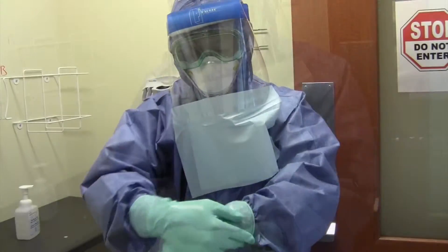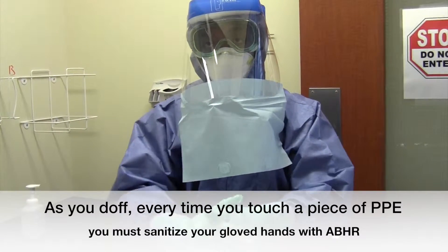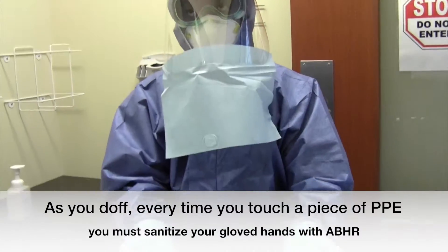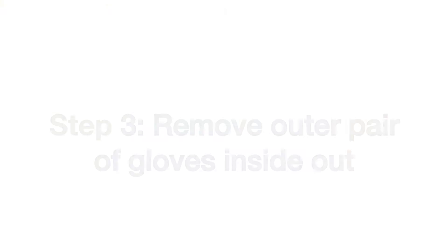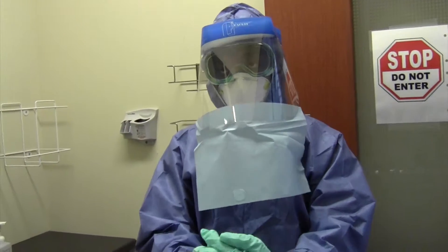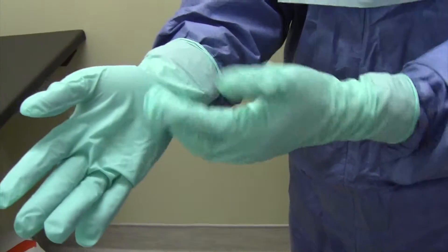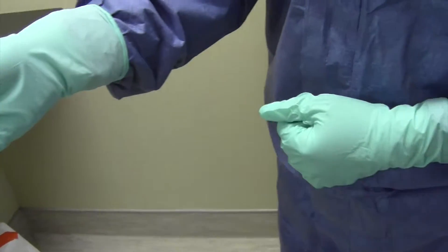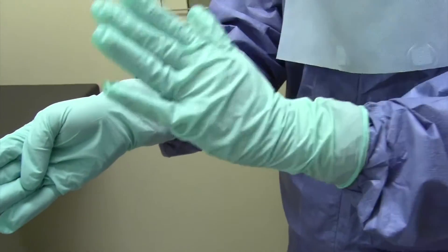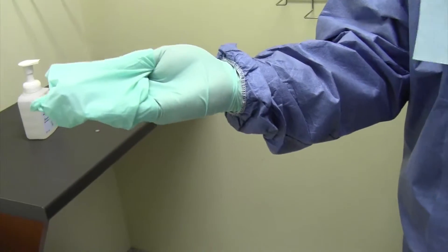You will notice as we go through the doffing process that every time PPE is touched, gloved hands are sanitized with alcohol-based hand rub. Step 3: Remove outer pair of gloves inside out. When doffing the gloves, ensure that you touch only the outside with the outside and inside with the inside — dirty to dirty, clean to clean. Place your thumb on the inside palm of your hand to allow easier removal with the opposing gloved hand, then pinch approximately one inch above your cuff and remove the gloves inside out only halfway.